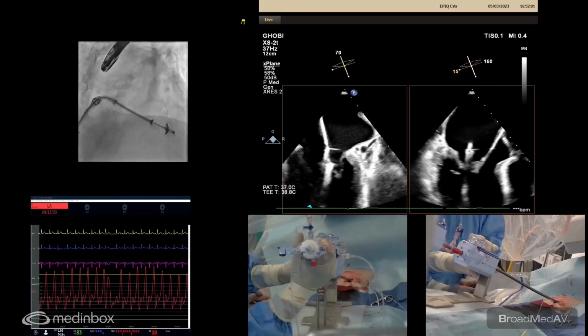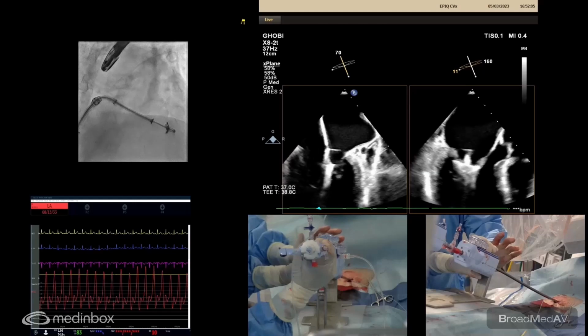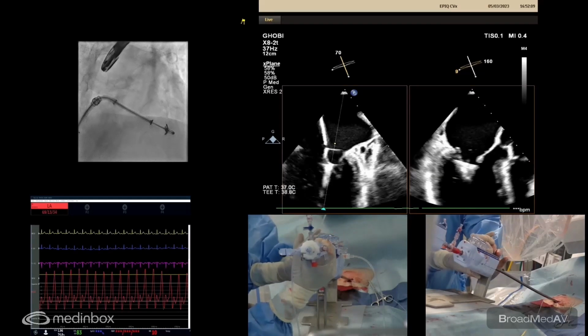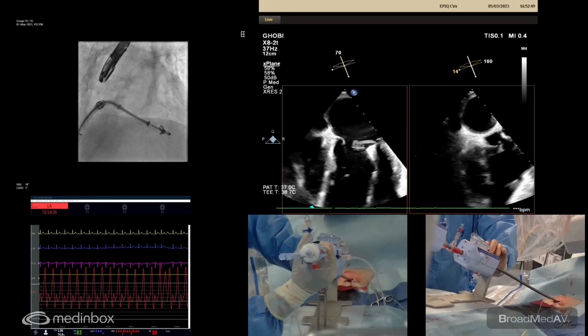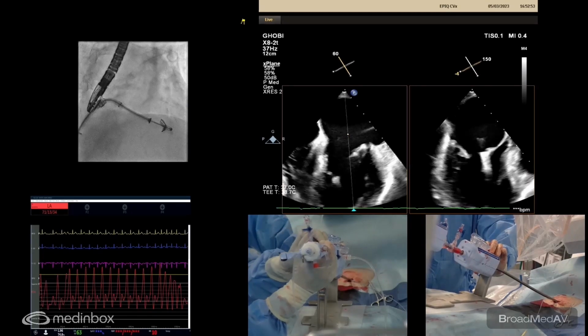Since this time it's a lateral side, hold it like this, please, for me. I don't mind taking this side. And then one medial to it. Yes. Okay. So that's also, hold it like this, please. I think it's good to go for the prolapse there laterally, but I think the anterior is still interacting with the anterior clip arm. I agree with you.